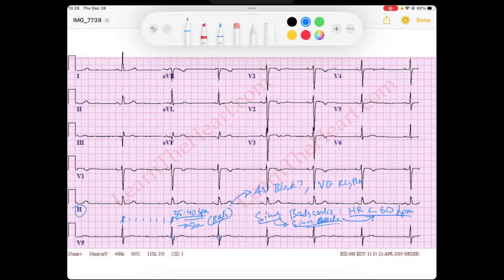Let's look for maybe here in lead two. We'll see, we've got these P waves that are conducting to QRSs, P waves conducting to QRSs. And we don't see any P waves in between that are being missed. So, that's reassuring.